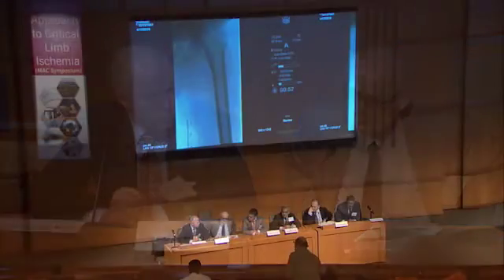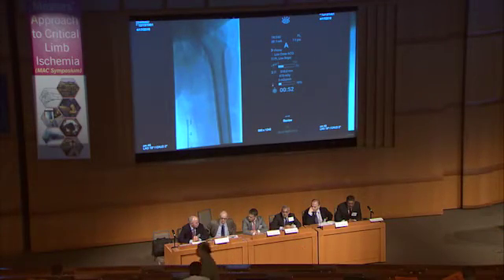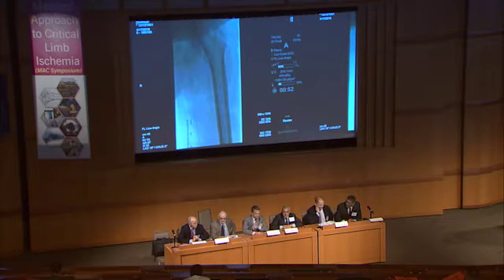Well, I think you've got to treat it. I would just treat it with a covered stent and then probably consider embolizing whatever you need to embolize in the profunda. But if there would be major AV communications now coming from the SFA, you could distinguish this from balloon inflation related minor communication. So it would be really interesting to see.